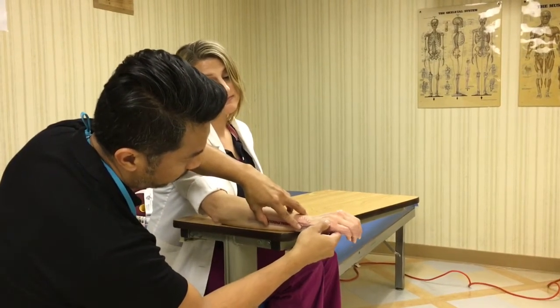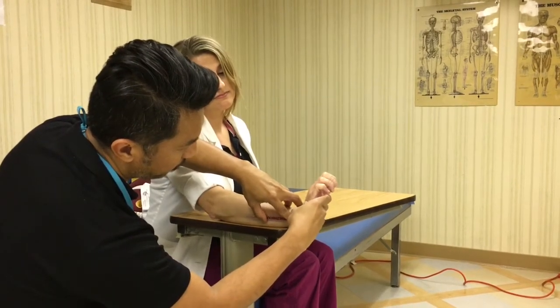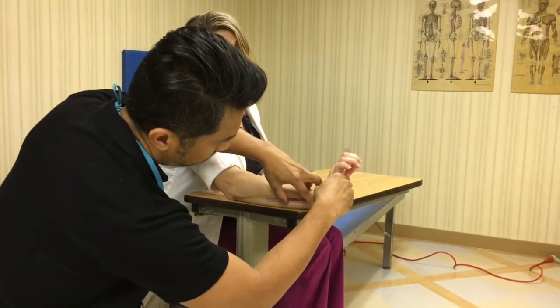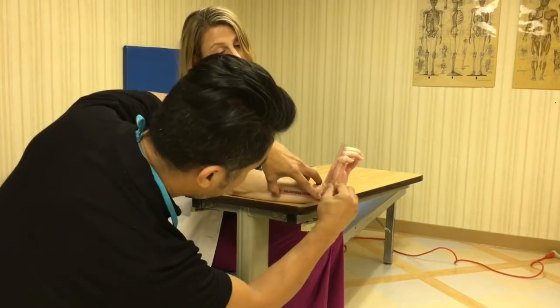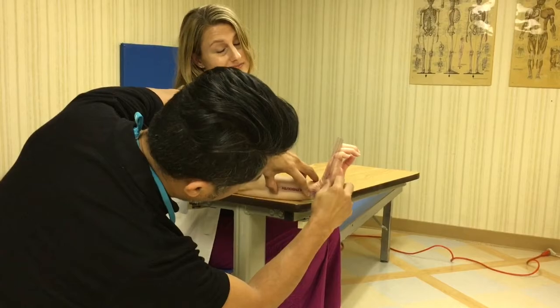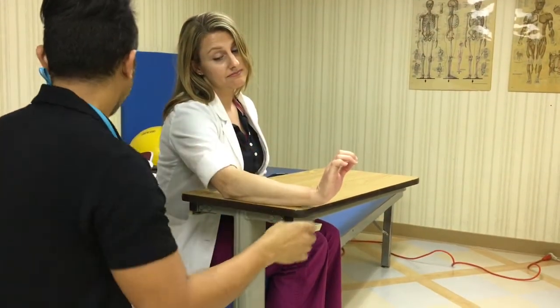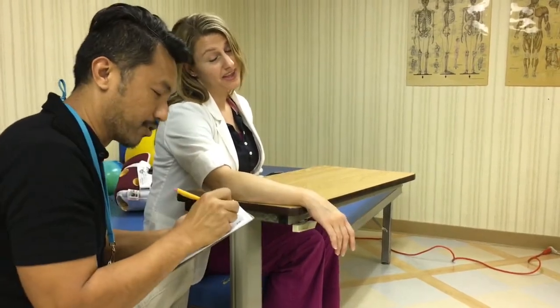Okay, Stephanie, go ahead and extend your wrist. Okay, 75. She seems to have the same wrist flexion and extension. Go ahead and relax.